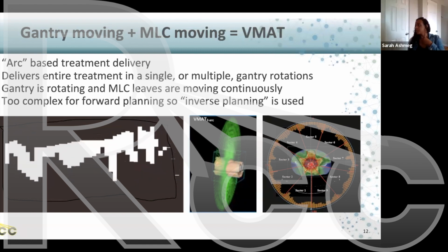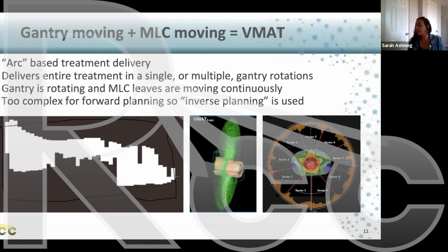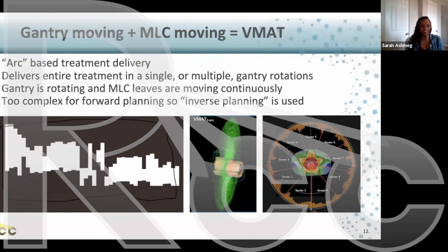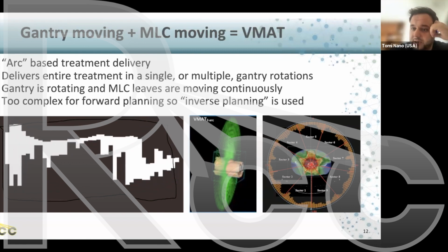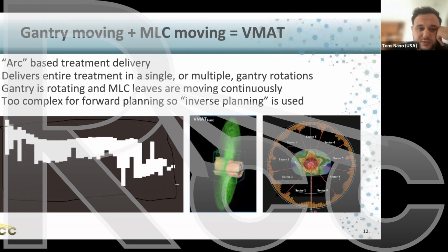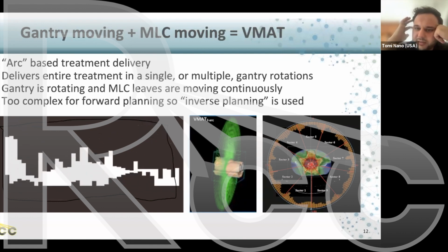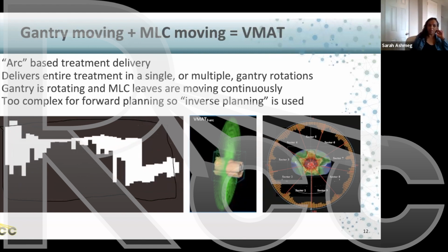Building on that, there's a question that's been asked numerous times: please tell us why not use high energy, basically 10, 15, 23 MV, for IMRT or VMAT. Essentially, it's the photon neutron production that limits a lot of the uses for us. Very rarely do we use 15 or 18, only for very deep-seated tumors, and only if you can't achieve reasonable results with 6 MV.